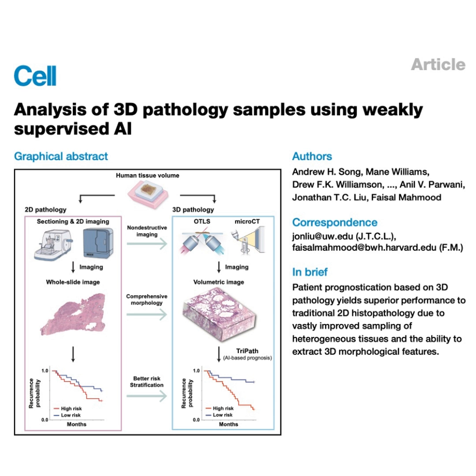So the AI essentially learned to recognize established prognostic biomarkers on its own, just from the weak supervision of patient outcomes. Yes, but with a crucial difference. It learned to recognize them within their 3D context and quantify their extent and severity across the entire volume, something that's incredibly hard for humans to do consistently from 2D slices. It confirms the AI is learning clinically relevant information. And it's leveraging the 3D information to do it more effectively. That seems to be the key.